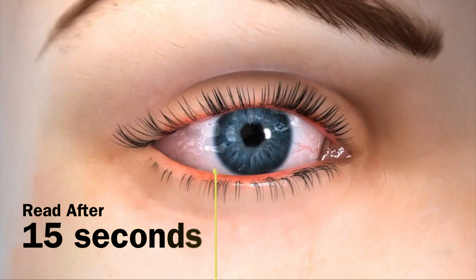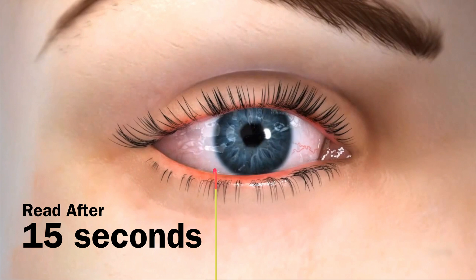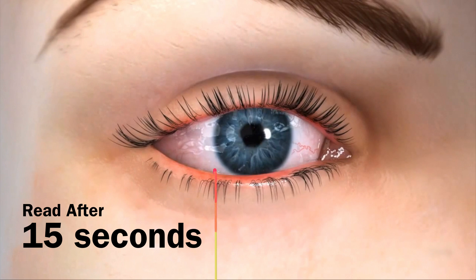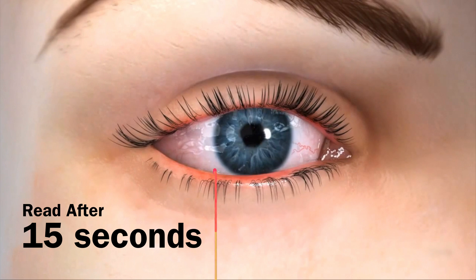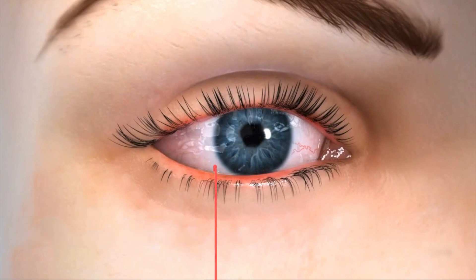The test is performed by placing the tip of the thread under the lower eyelid. As the thread absorbs the tears produced by the lacrimal gland, it turns red. After 15 seconds, the thread is removed and measured.